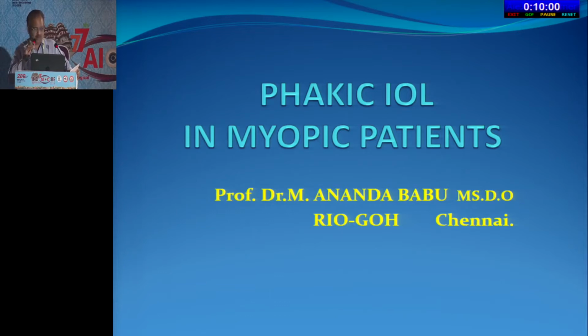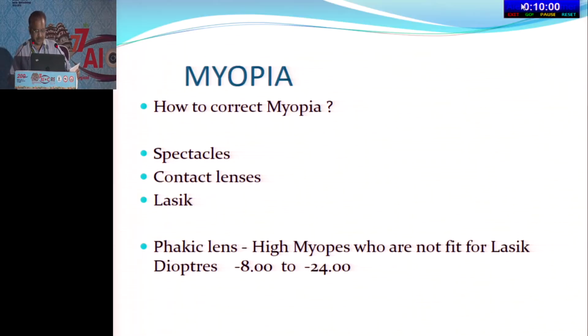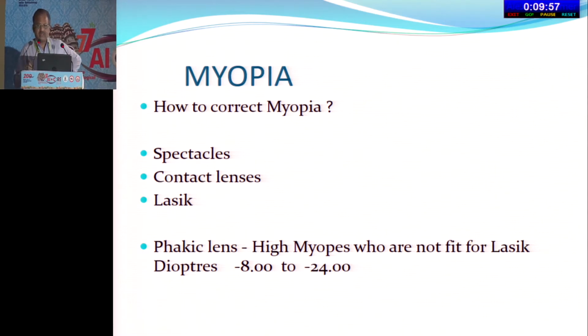Phakic IOL in myopic patients. How to correct myopia? Spectacles, contact lenses, and LASIK and phakic lens. Phakic lenses are used in high myopes who are not fit for LASIK.